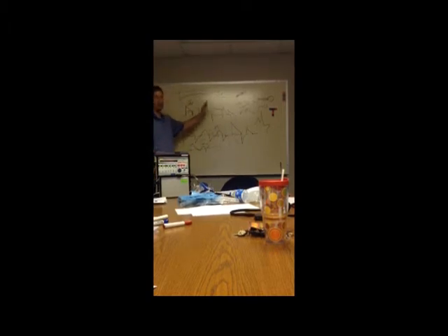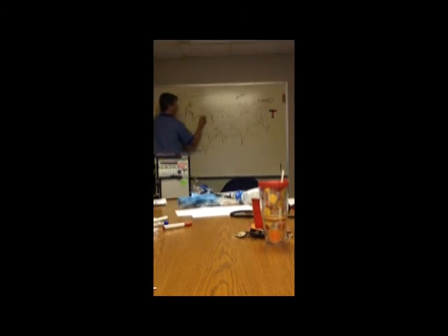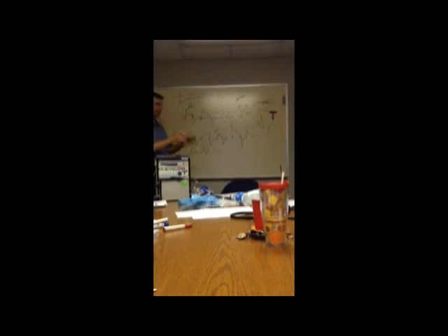And what the machine's doing in this one, it's time for a breath, same pattern of breathing in this as there is this. When the time comes, it's going to start the breath. If the patient triggers it, it's going to start, and it's still going to give them the full breath. The pattern is the same. The difference is, once that breath is started, how it's delivered. That's the difference between this and this.